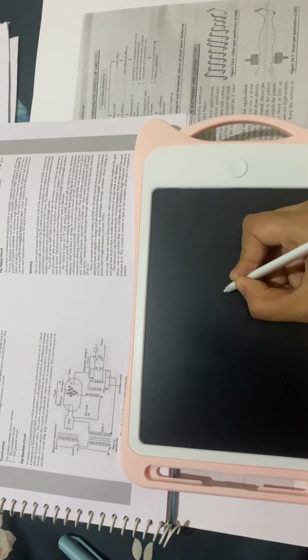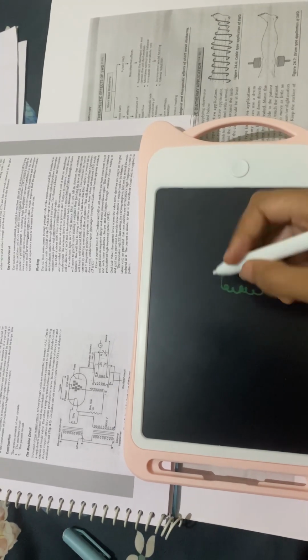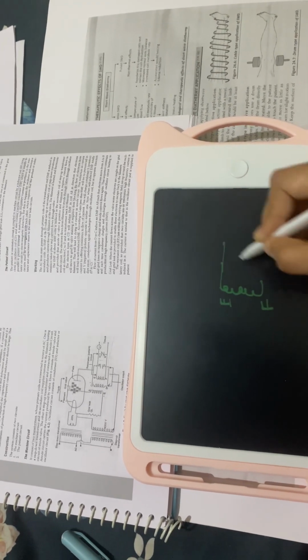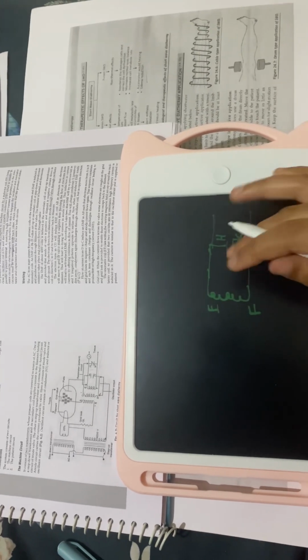So the inductance is EF, this is the inductance coil, and a condenser which is known as HK. This is the patient circuit or the resonator circuit.